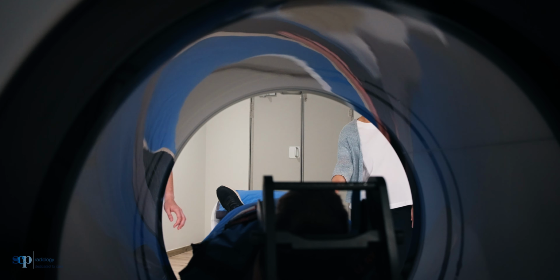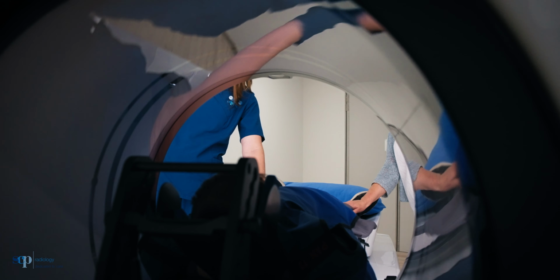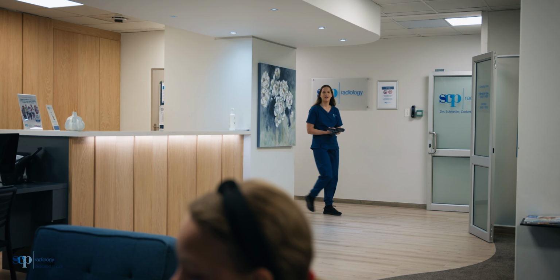It's definitely beneficial for children due to the lower radiation dose, and also focusing on the smaller area, providing that detail for the doctor to use when they go for cochlear implants.